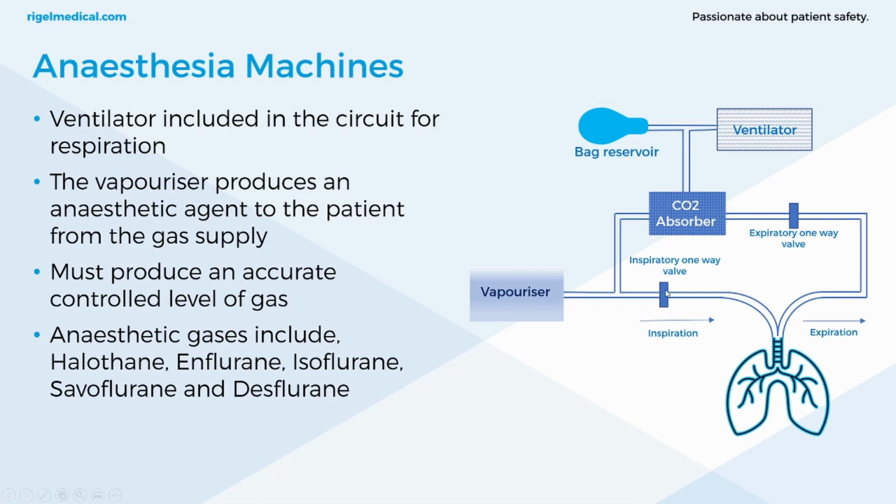So we're introducing new parameters to be measured with the ventilator. We're not just talking about the ventilator anymore. We're adding different factors where it's important that there's controlled, accurate levels of these anesthetic agents.